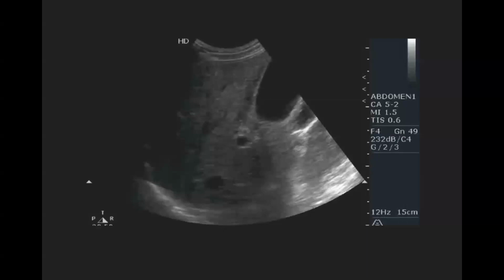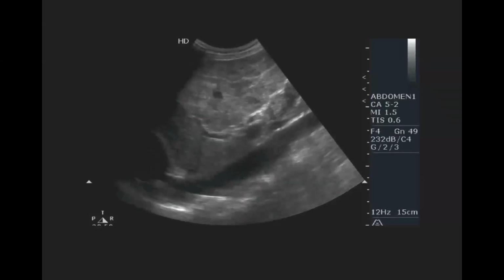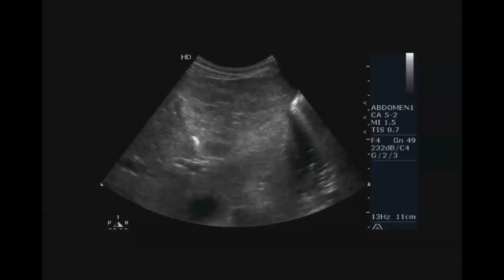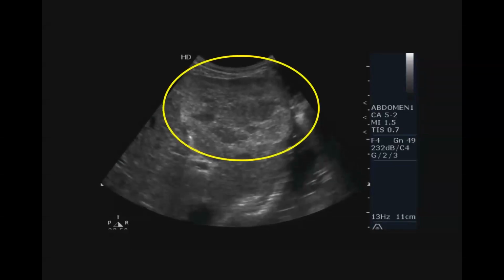And then this is actually from a patient who was in our CDU with chest pain. And I came the next morning and it seemed to be more like right upper quadrant pain. So of course I grabbed the ultrasound and I scanned through, and the gallbladder looked fine, but there's this kind of Swiss cheese thing looking there. And so that's the sagittal view, and take a look with the transverse view. And again, the gallbladder looks fine, but this is definitely not really normal.